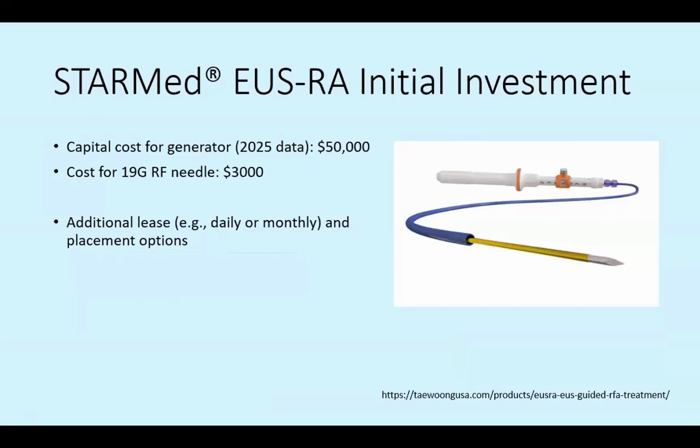When it comes to radiofrequency ablation, when we have previously discussed the needle that's used, that's approximately $3,000 per needle. In terms of the generator, that's about $50,000, but they do also offer some lease options, as well as some different placement options.